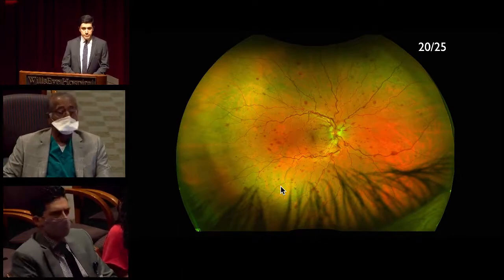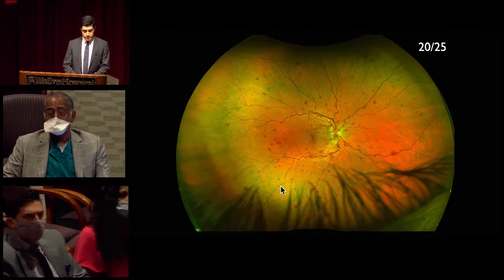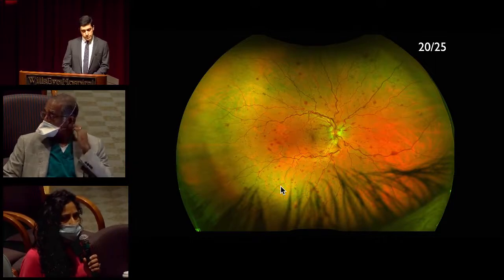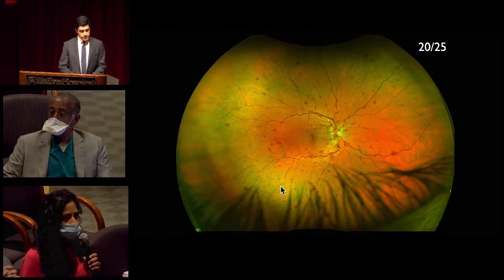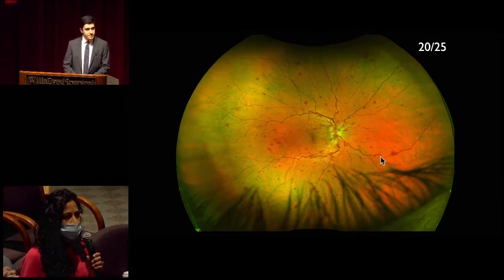So here we have a pseudocolor wide field fundus photo of the right eye. Vision is 20/25. Media appears clear. Looking at the disc margin, you can see this blurred disc margin, 360 degrees, with this circumpapillary flame-shaped hemorrhages. Looking at the vasculature, diffusely, the arteries, more so the veins, appear dilated and tortuous in their course and caliber. And then we can see these diffuse, what appear to be intraretinal hemorrhages, in this blot-like pattern in the periphery as well as in the macula.